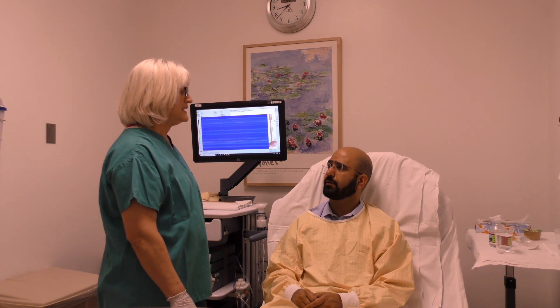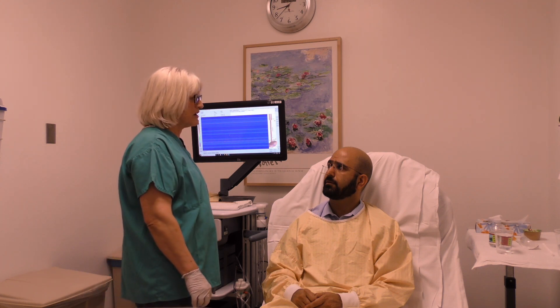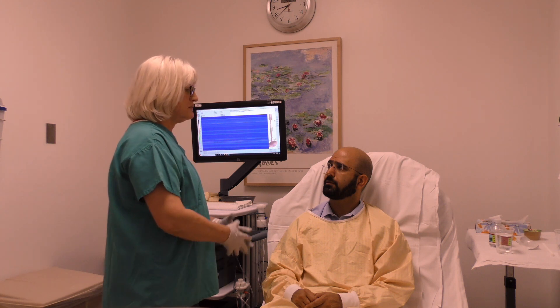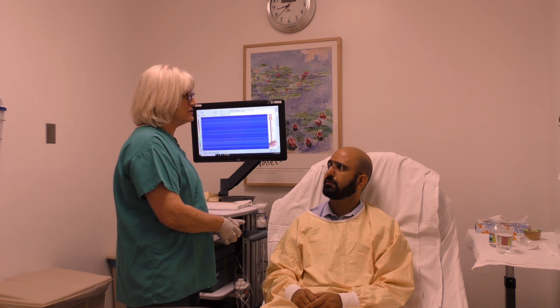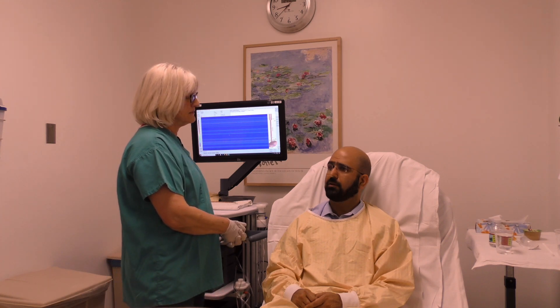You might need to sip and swallow more than 10 times. Also, Dr. Kishishot may ask you to swallow applesauce or crackers. After the test is finished, the catheter will be removed. In a few minutes the doctor will come in and talk to you some more, and then she will start the procedure. Do you have any questions? No.